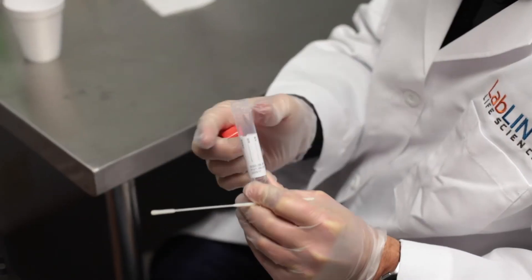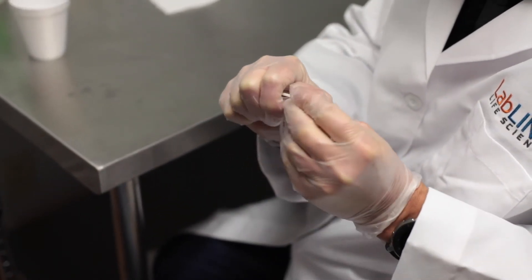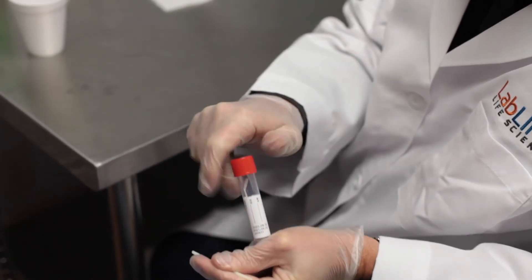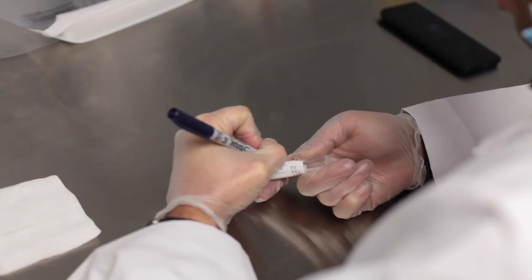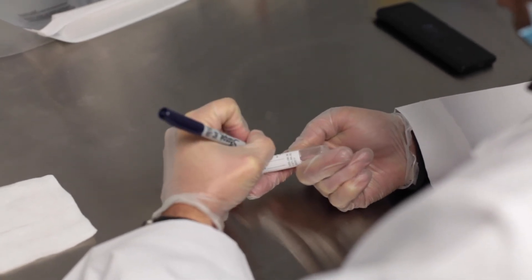Slowly and carefully remove the swab from the patient's mouth and dip the swab tip into a tube containing your viral transport media. Discard the tail of the swab and seal the cap tightly. Label the tube with the patient's name, date of birth, and collection time and date.